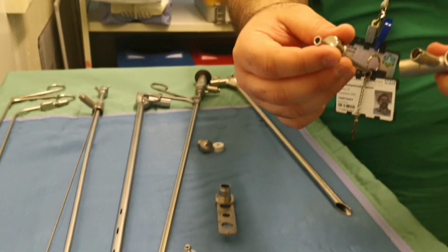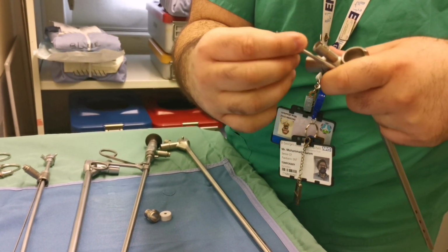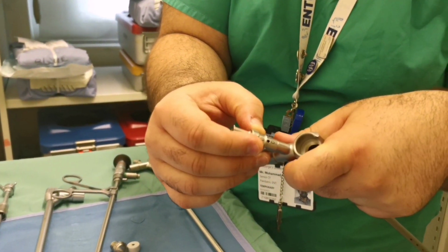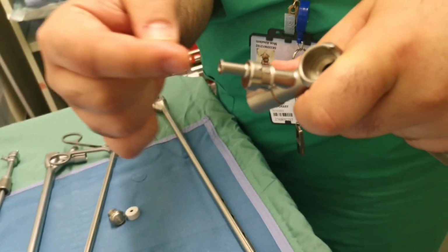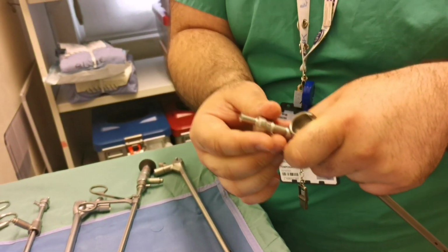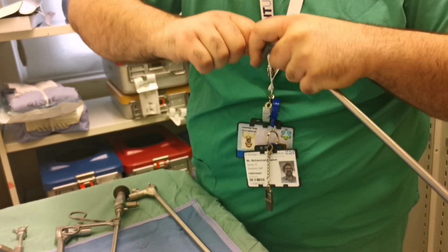And for the suction area, we have different gadgets here. So we have a cannula introducing bit, which we can use for cannulas or injection. You need to make sure that the 0 meets the 0 here, so it clicks 0 on 0, so that whenever you put a cannula for injection, it does not get blocked. That is for cannula introduction.